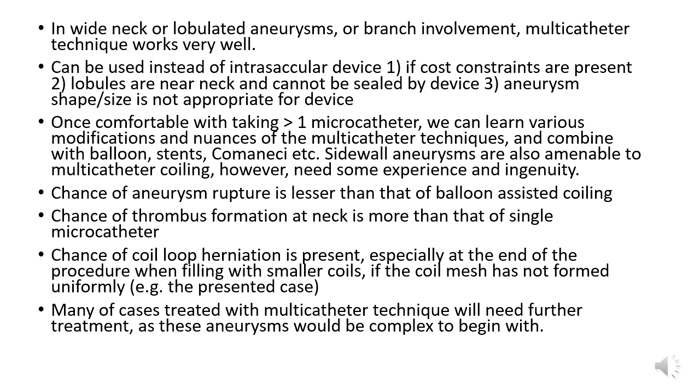So basically, instead of using a balloon, which can create some complexity, you can use this multi-catheter technique. You have to use the guide sheath. If you're using only two micro systems, like one balloon and one microcatheter or two microcatheters, then any system is okay, any guide catheter is okay.